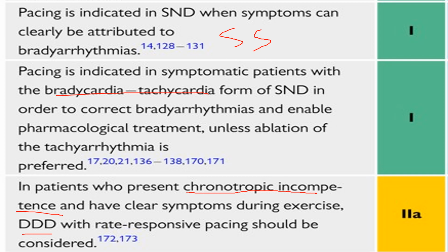But the studies have suggested that in the long term, these types of patients might also develop AV node disease in 1 to 2% of patients. So they will need a double chamber or dual chamber pacemaker. The guidelines suggest that dual chamber pacemakers are always preferred even in isolated sinus node dysfunction. The other option will be a single chamber in the atria, that is called an AAIR pacemaker.